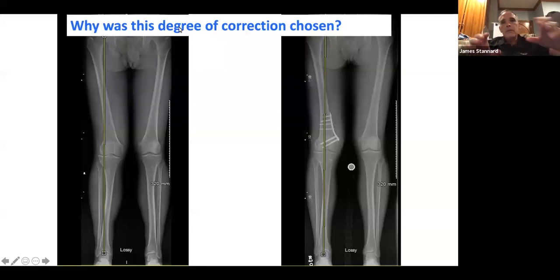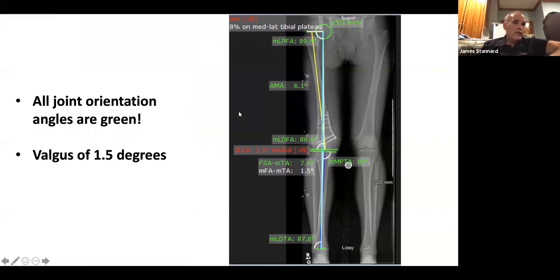Well, one thing I'll say, I don't know the answer to your question of how much we should use the arthroscopy, but that was a close-up of the back of the tibial plateau and the flexed femoral condyle. When you go into full extension and you're looking more at the front, it's got decent cartilage, and that's why the person was handling it okay until they then blew up the other side, and then things were starting to go downhill fast. So that's why I think the osteotomy is a really viable option here, because the back part of that joint is not good, but the front part and the joint in full extension is actually not horrible. It is with a non-functioning lateral meniscus, but he'd handled that for 47 years.